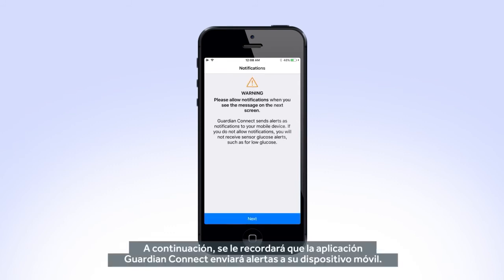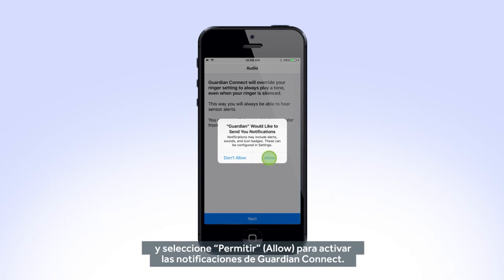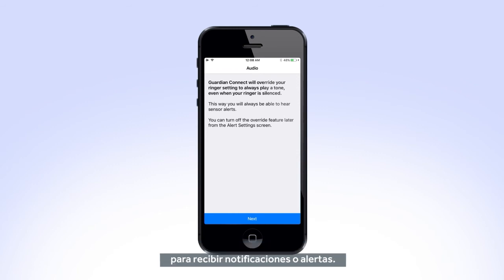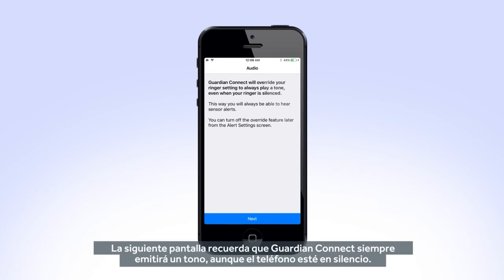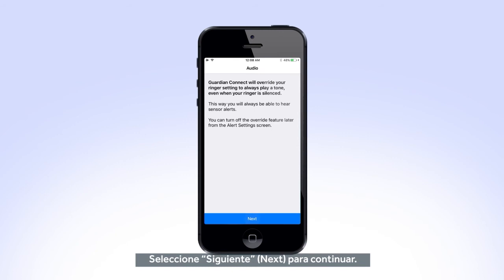Next, you will be reminded that the Guardian Connect app will send alerts to your mobile device. Tap Next to continue and select Allow to turn on Guardian Connect notifications. Keep in mind, your app must be open or running in the background to receive notifications or alerts. The next screen reminds that Guardian Connect will always play a tone, even if your phone is set to silent. This is to ensure you will always receive your sensor glucose alerts. Select Next to continue.